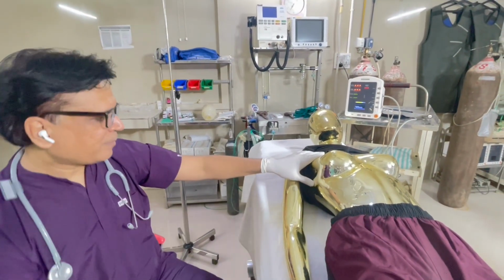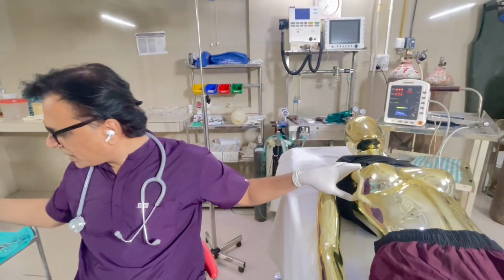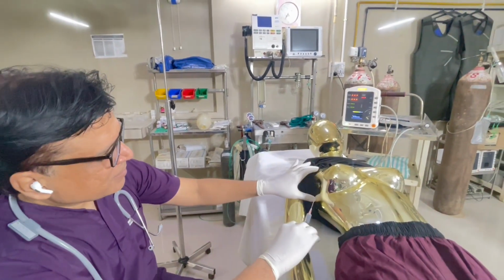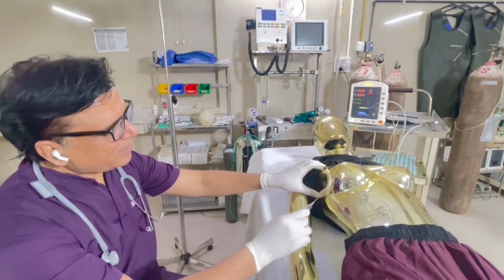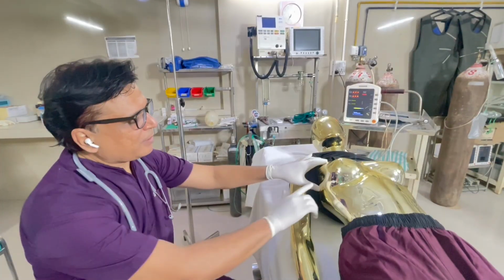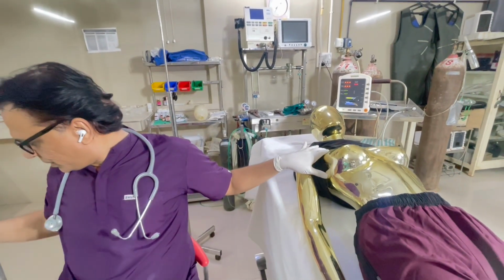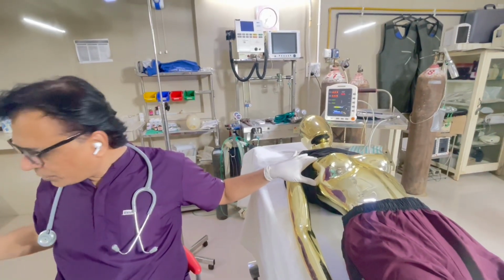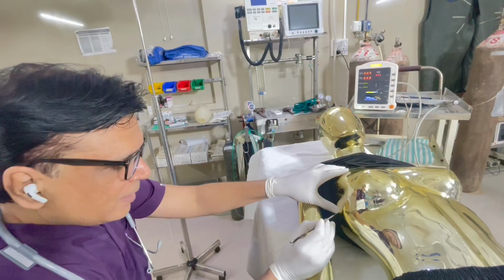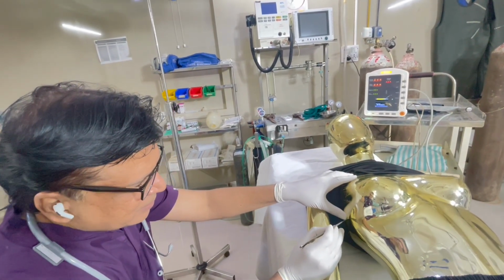You will ask the patient that I will be putting a numbing agent, and if the patient is already anesthetized, there is no need. I've put a local xylocaine, in such a manner that it should be at the upper border of the fifth rib. Then if you are putting a 26, take an incision of around 1.5 centimeter, horizontal, on the intercostal space.